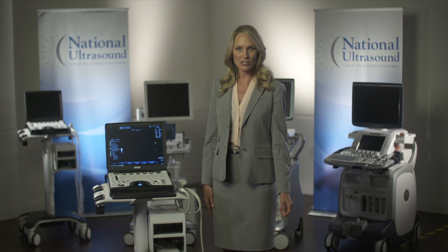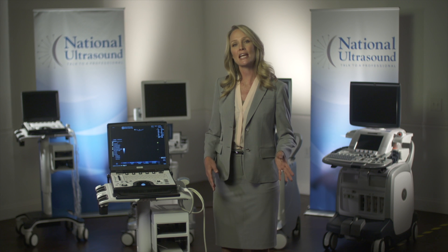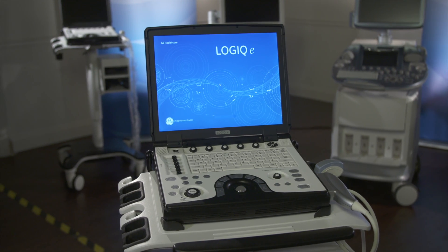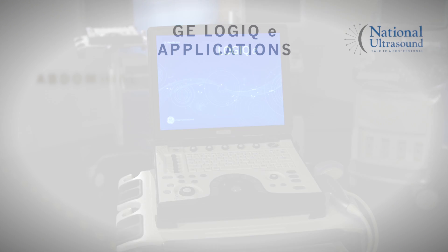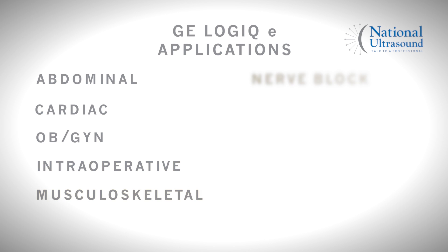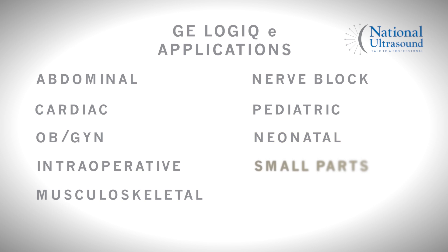Hi, I'm Andrea with National Ultrasound, and we're going to take a moment to look at the GE Logic E. The GE Logic E is primarily used for abdominal, cardiac, OBGYN, intraoperative, musculoskeletal, nerve block, pediatric, neonatal, small parts, urological, and vascular applications.